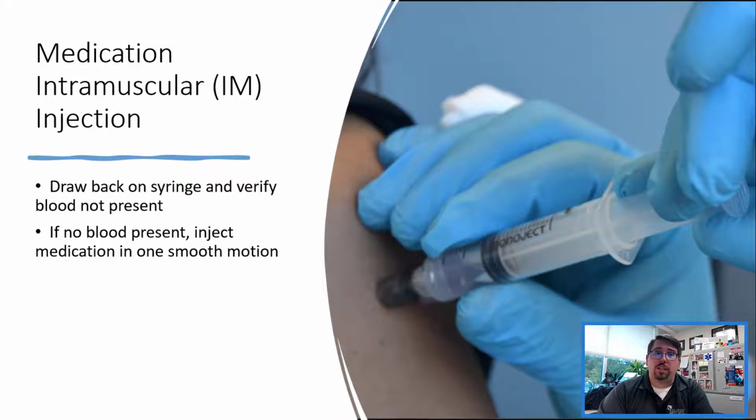We want to make sure that we're having it slowly absorb into the muscle so we get that prolonged effect. If there's no blood present, go ahead and inject the medication in one smooth motion, one smooth bolus.